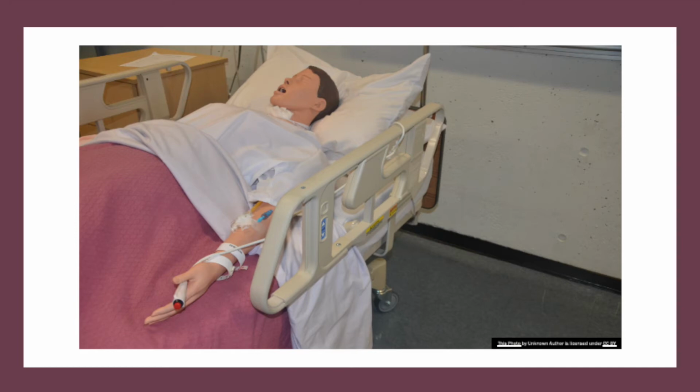When explaining the procedure, reassure the patient that they shouldn't experience any pain and avoid using the word electrical at any point. A good way to say this is, we want to see how your heart is functioning and make sure that there are no abnormalities. Get them to remove any upper garments and make sure they are comfortable on the bed.